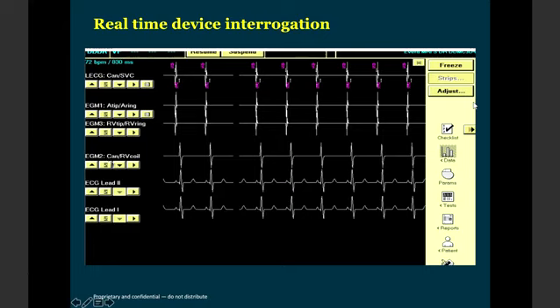The fourth one, if you see here, is also a ventricular electrogram, but is recorded between the CAN, the active CAN of the device, and the RV defibrillator coil. This is called a far field electrogram. So this is a leadless ECG. This is an atrial electrogram. This is a ventricular near field electrogram because it is tip to ring.